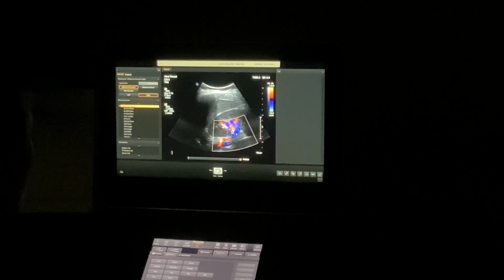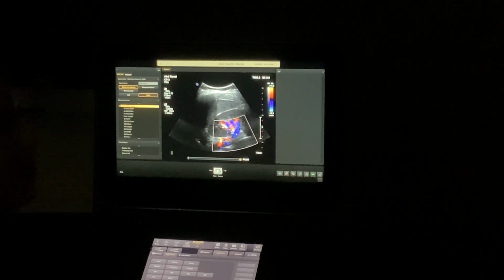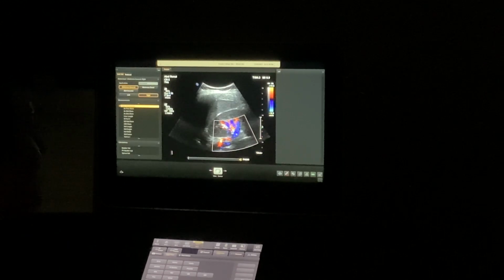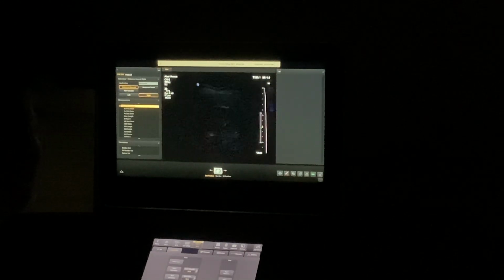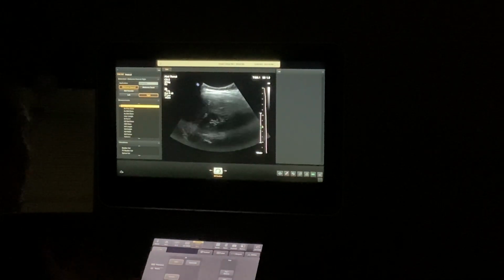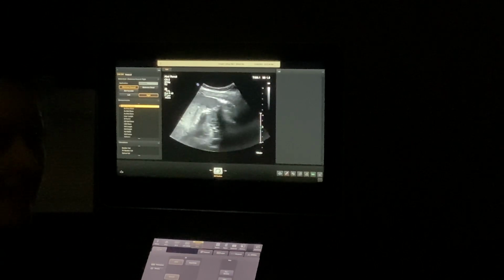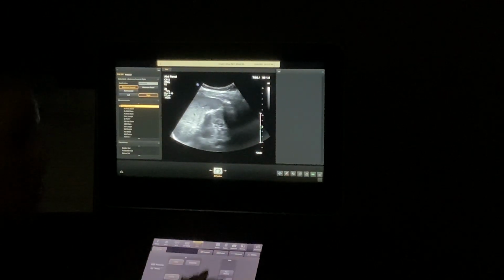Okay. So there's a lot of different windows for you to see other things whenever the primary one doesn't work. Pancreas. You can see my pancreatic tail from this view of my spleen because they sit that close together. It's just how she's made, it makes it easier to see. So find that magic window. All right. So that's really, with the left kidney, it's the exact same things I showed you on the right. It's no different. This is gonna be your more challenging kidney. The left is generally just always harder, okay?